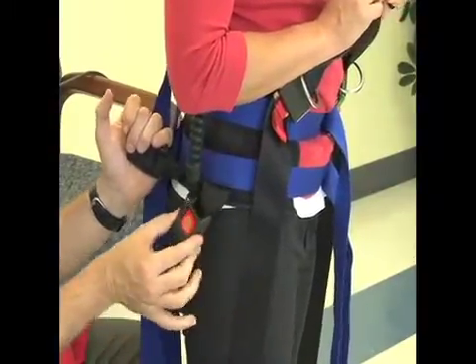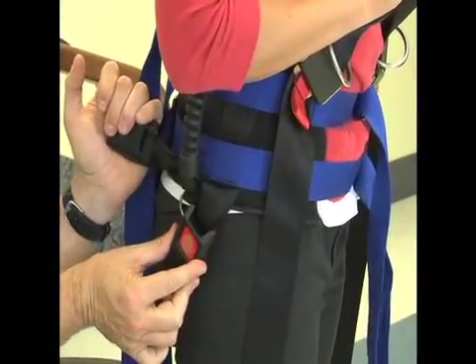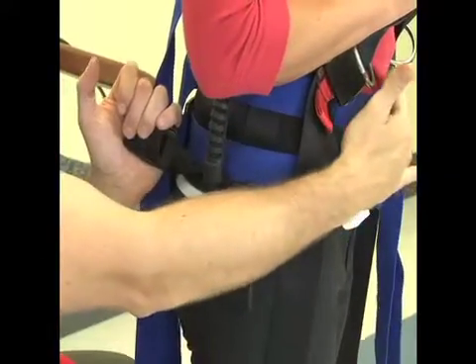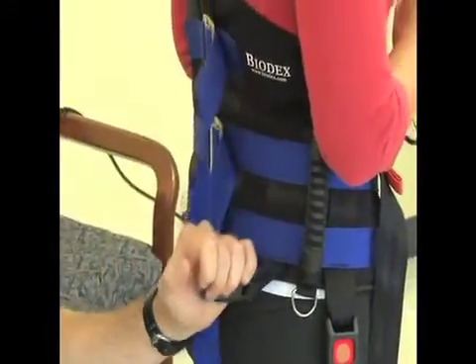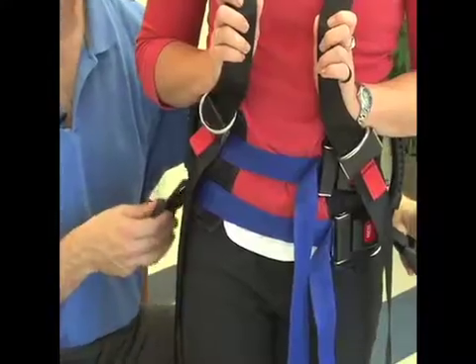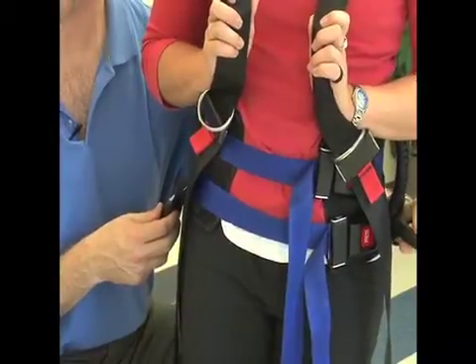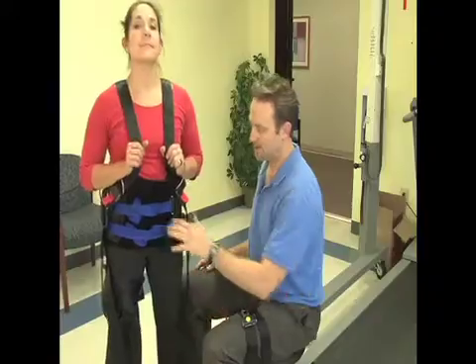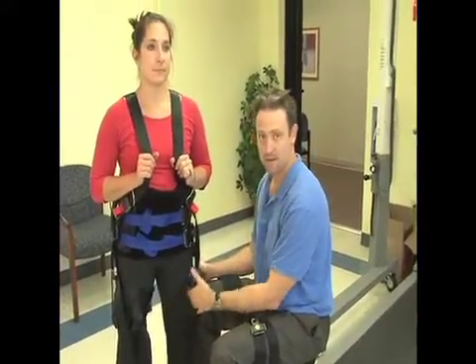If the buckle lines up posteriorly to the greater trochanter, then it's the opposite — the vest has to be tightened in the front and loosened in the back until the buckle lines up with the greater trochanter. If one buckle is posterior and the other buckle is anterior, then the vest might just need to be adjusted and turned. Now that we have the vest on, we're going to come down to the thigh and apply the thigh straps.